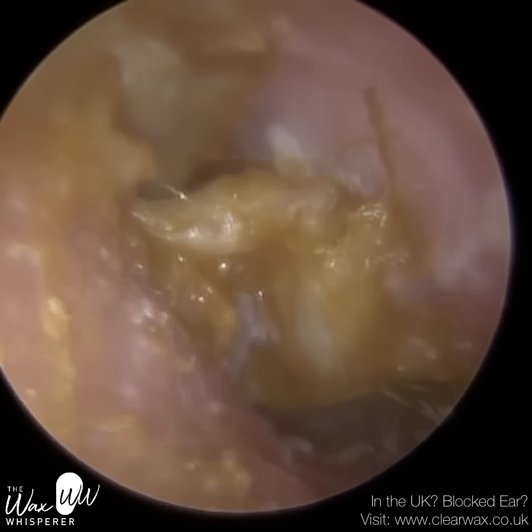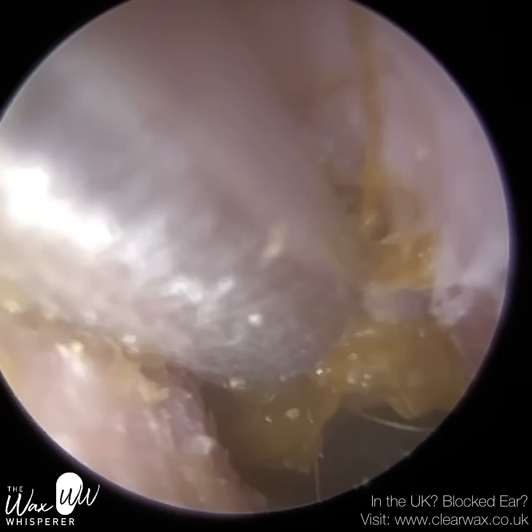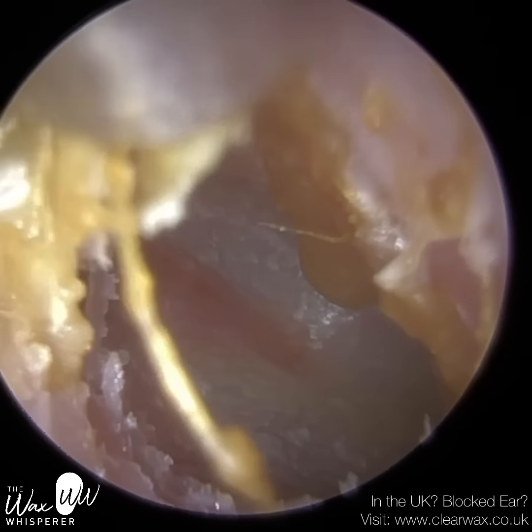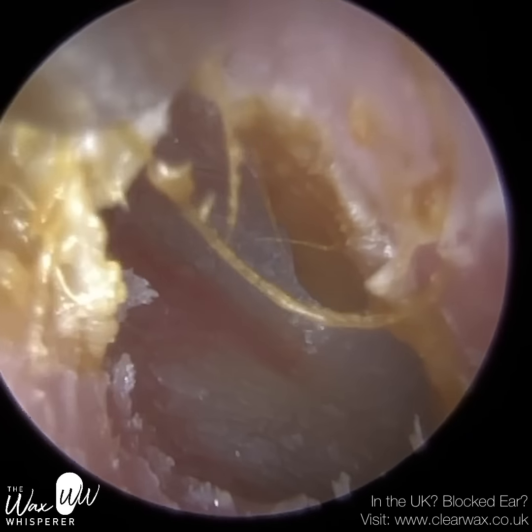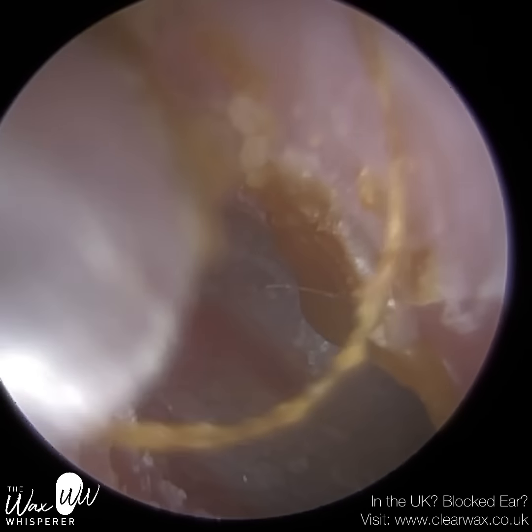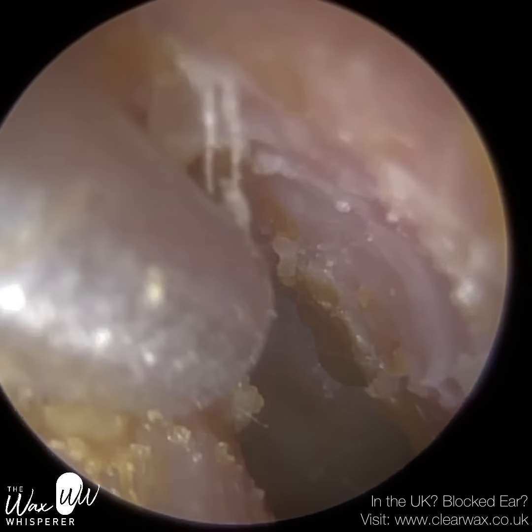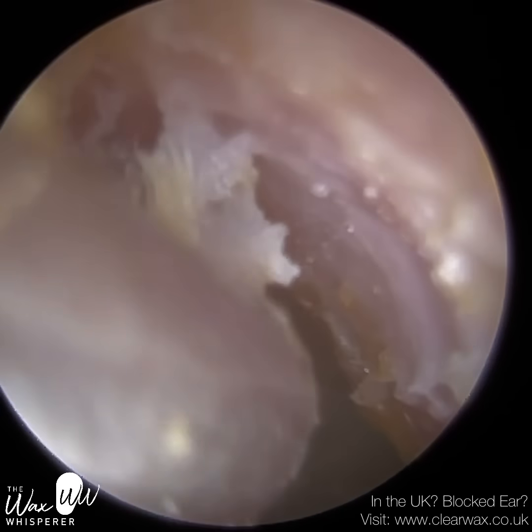You can see it really narrows deep in the ear. I can just about fit the Zollner suction probe in. The diameter of the Zollner suction probe is 2.2 millimeters, and we can just about fit it into the ear. So we see the eardrum already. In terms of their hearing, much better.